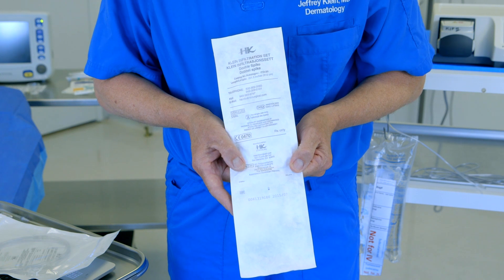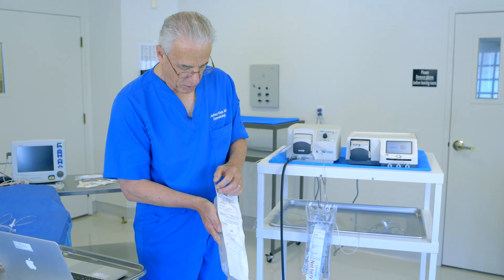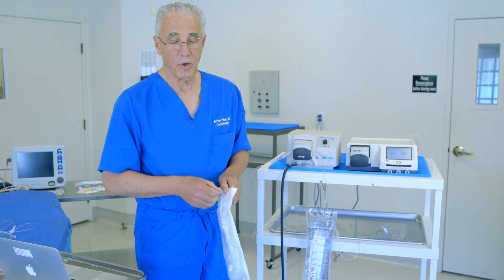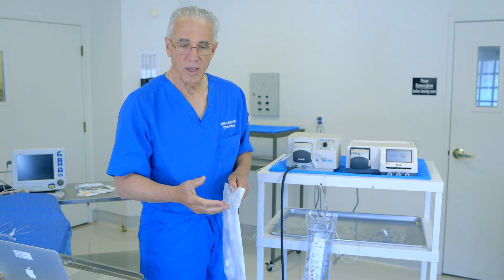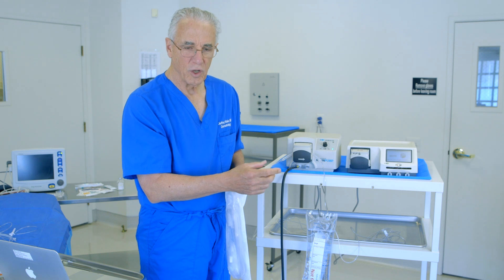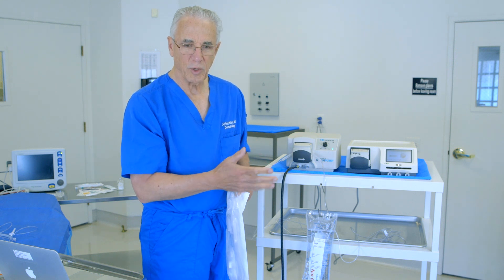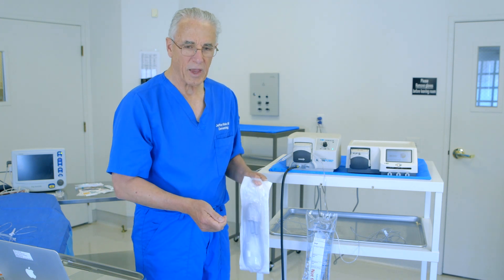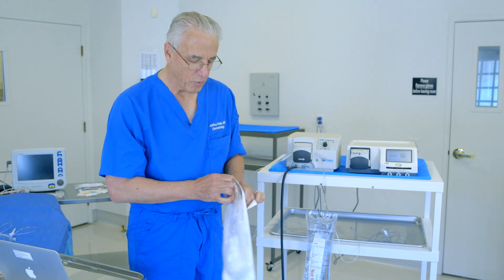This is a double spike — HK Surgical double spike infiltration tubing — and this is designed to allow you to use two different bags of tumescent anesthesia. For example, if you are infiltrating a large volume of fluid and you are about to exhaust the first bag, if the second bag is already hung and ready to go, you simply need to close off one pinch clamp, open the second pinch clamp, and the person doing the infiltration can proceed without interruption. Otherwise, there is time where the infiltrator has to stop, change the bag, put the spike in the new bag, and continue — that is a bit inefficient, so this improves efficiency.